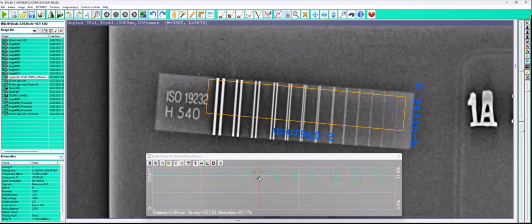So D1, D2, D3, D4, D5, D6, D7. That is unmodulated. So this panel is D7 unmodulated, or uninterpolated. Per code, we get the next line pair after. So we would actually say this is a D8. This would qualify for D8, which is 160 micron.